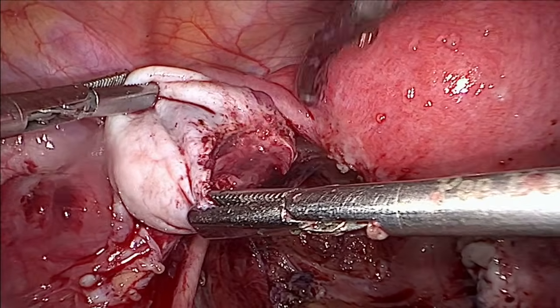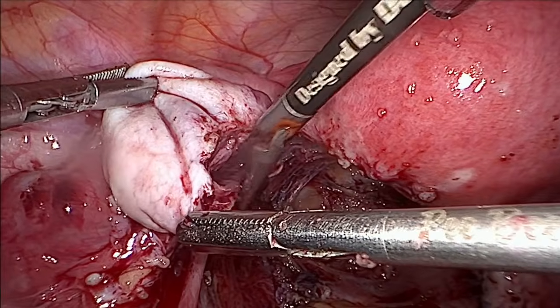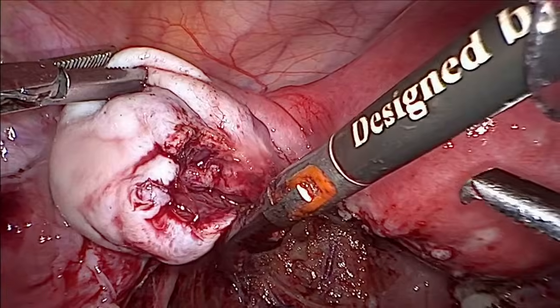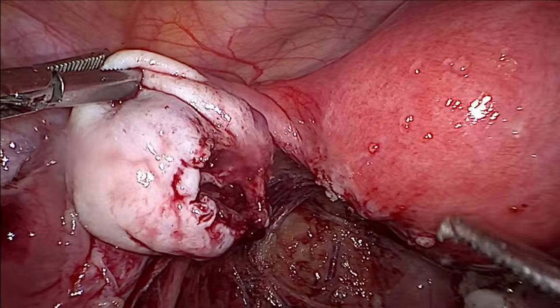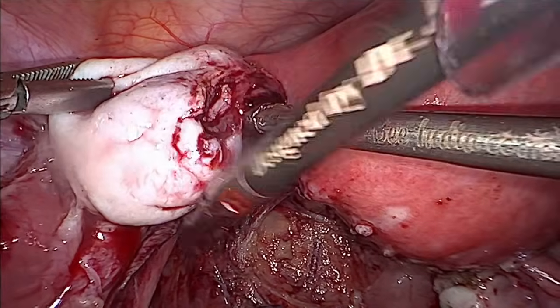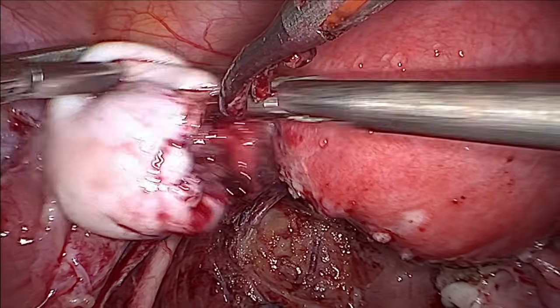I think there is no other cyst visible. Yeah, it's fine. Ovary looks fine. Okay, just to skip the traction as it is. So once you have a look at the completion part of it, okay, it's bleeding from here. I will just coagulate.